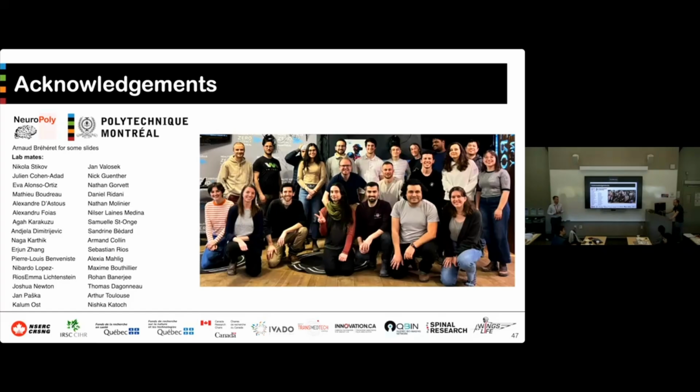I think with real time, if your image takes 4 minutes and you're breathing, if you see some ghosting, it can help. So real time can help. It doesn't hurt, it's just less noticeable in anatomical images. And I assume diffusion imaging. Yes. Awesome.